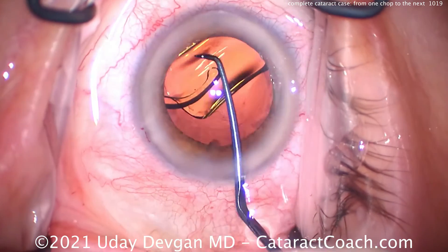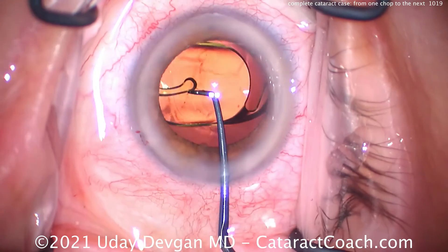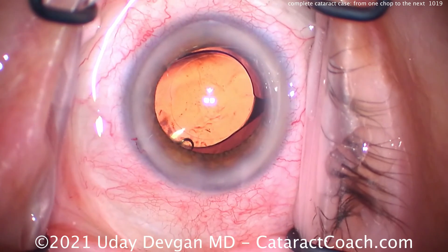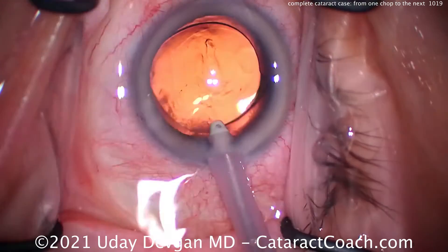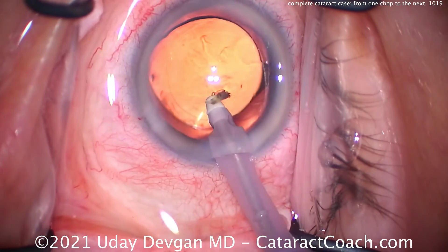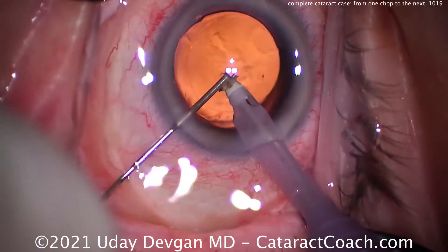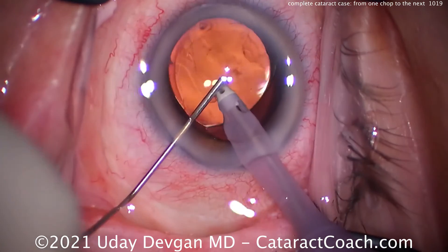So if you're a young surgeon watching this video, let me tell you — you're going to learn phaco chop. It's going to make all the difference in the world. If you're going to do cataract surgery for the rest of your life, you definitely want to evolve to these more advanced techniques. I stay with the cutting edge, so whatever happens with cataract surgery in the future — any new technologies, new techniques — I want to learn them all. That's the beauty of the CataractCoach website: we keep up with everything.